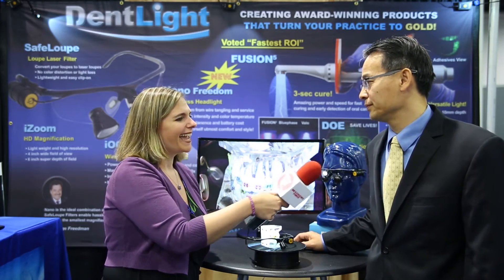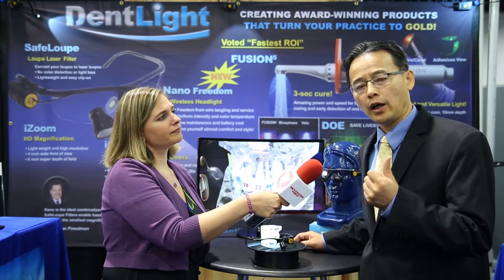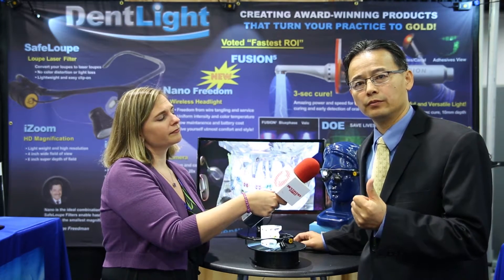Dr. Liu, good to see you today. Thank you so much. Now we're gonna get right down to it. You have three brand new product launches and the technology here really is amazing. Tell me what you have today. Yes, we are launching three new wireless products: the Iocam Loop camera system, Nano Freedom Loop light, and a new upgrade called Fusion 5.